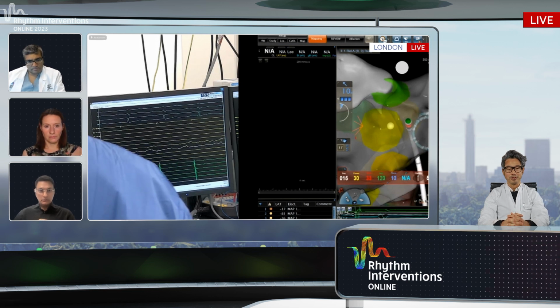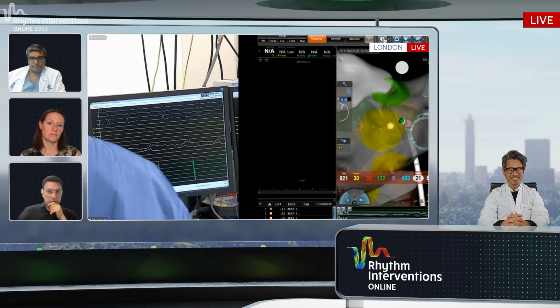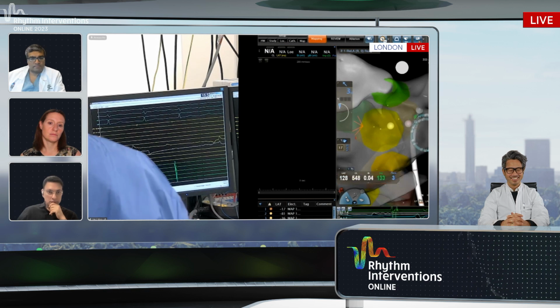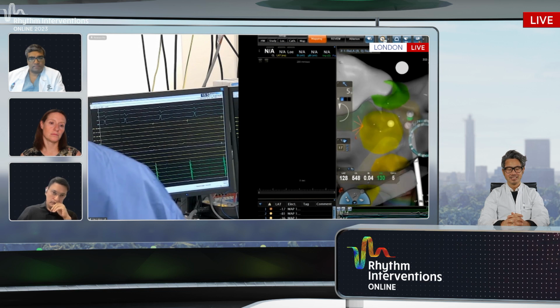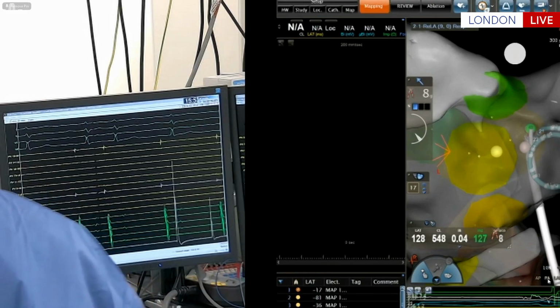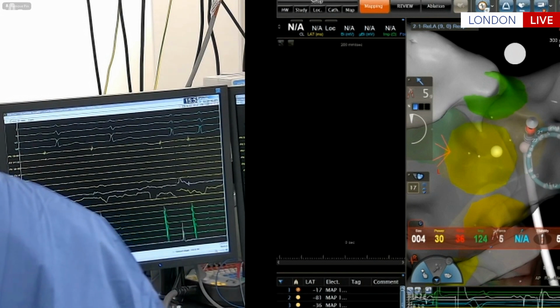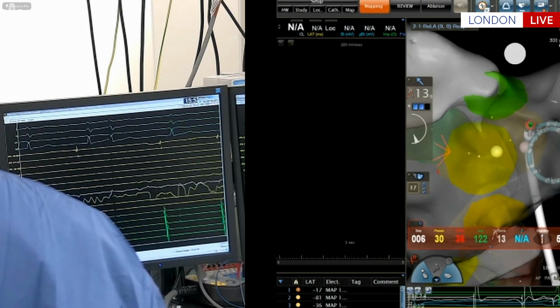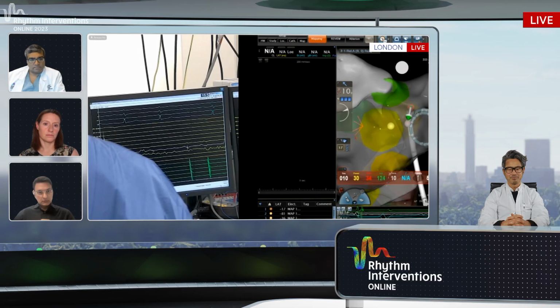Probably you know perfectly the time to isolation for all those veins. Well, interestingly, I'm much more interested in the temperature from isolation to ultimate temperature, because sometimes I'll move the balloon to seal it off. And so for me, there you go, there's the isolation on the vein there. Now it changed, yeah.